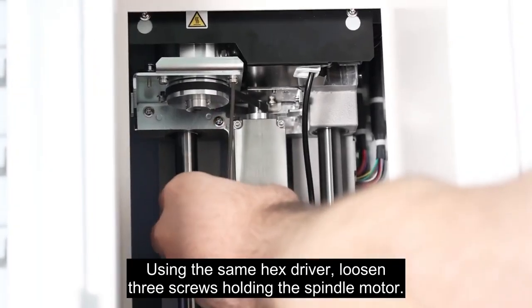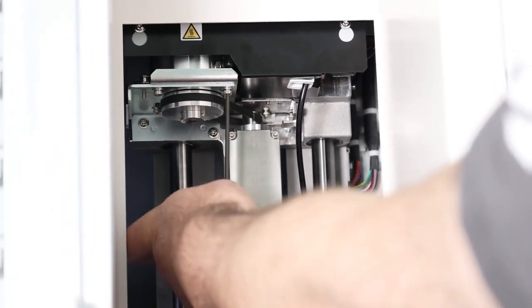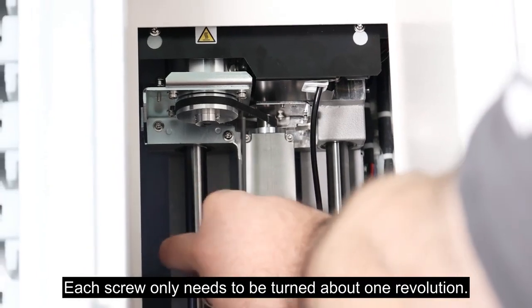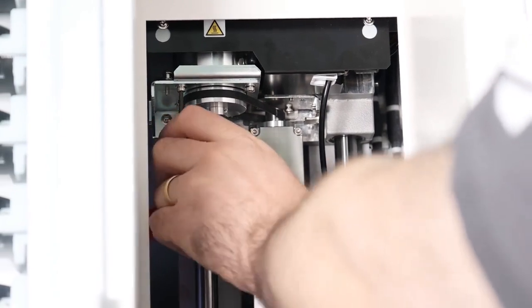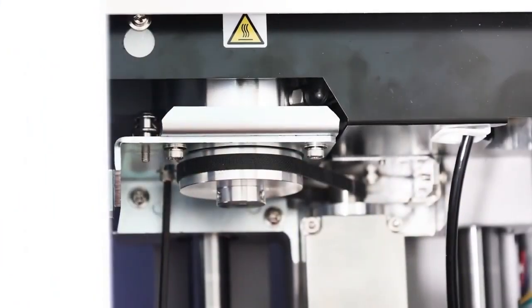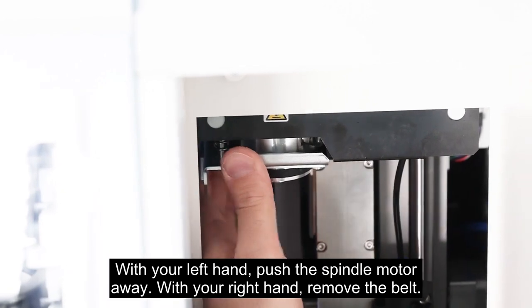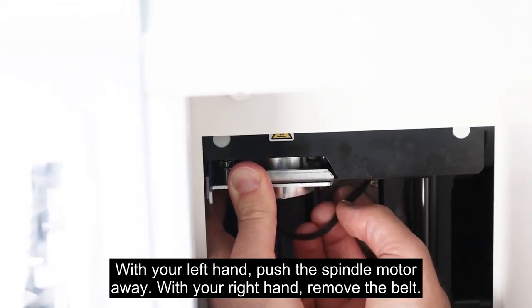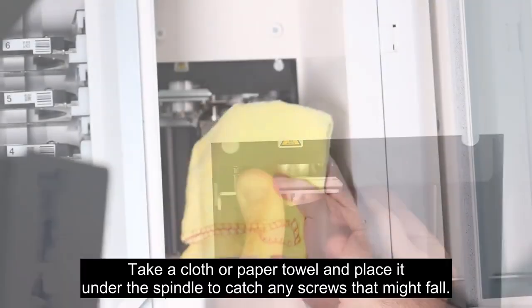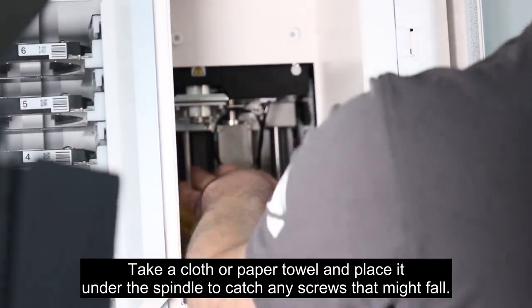Using the same hex driver, loosen 3 screws holding the spindle motor. Each screw only needs to be turned about 1 revolution. With your left hand, push the spindle motor away. With your right hand, remove the belt. Take a cloth or paper towel and place it under the spindle to catch any screws that might fall.